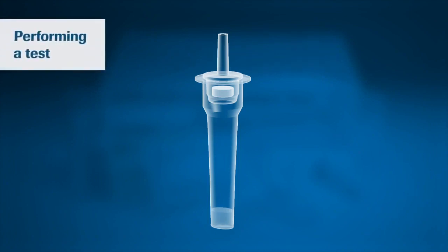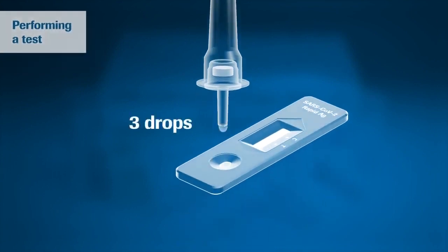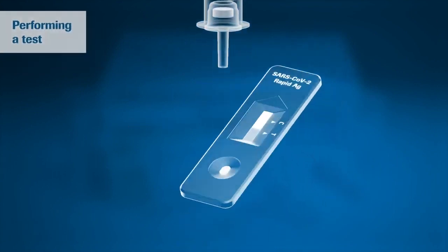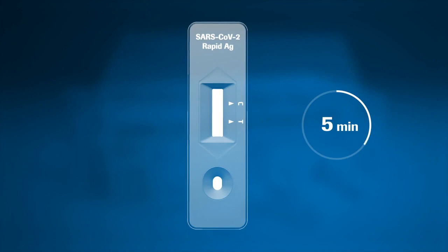You are ready to perform your test. Turn the tube and apply three drops of extracted sample to the specimen well of the test device. You can now wait for the test results. For accurate results, allow 15 minutes to read the test. Do not read the test after 30 minutes.